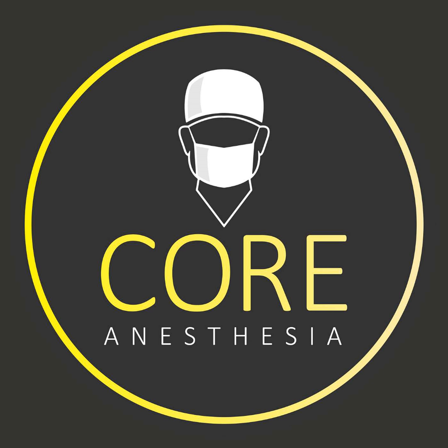Here you've got a lot of tissue with the tongue, soft palate, all of that, that's going to be keeping the tube mostly in place. So what you can do here is actually bring your glide scope blade back just a touch. It sounds counterintuitive. It seems like you want to just go farther into the vallecula and just lift up out of the way and get a better view. But if your vocal cords are too high, actually pulling your blade back just a hair is going to allow some of the pressure to come off and allow those vocal cords to drop down a little bit.